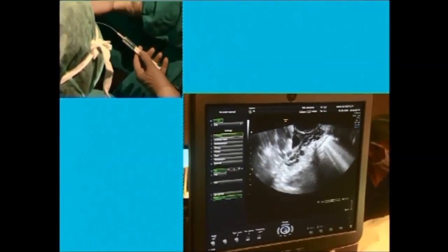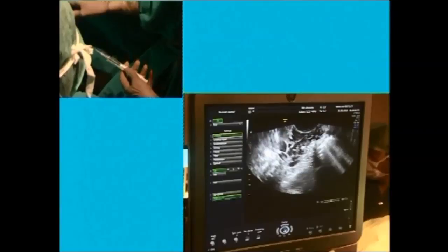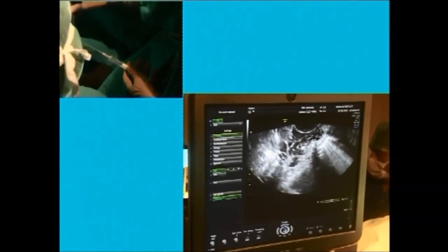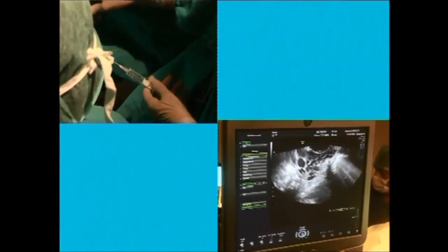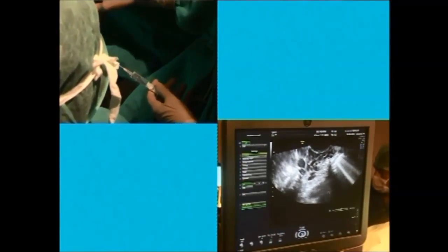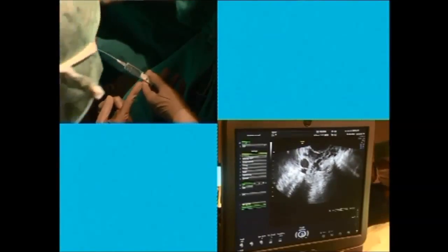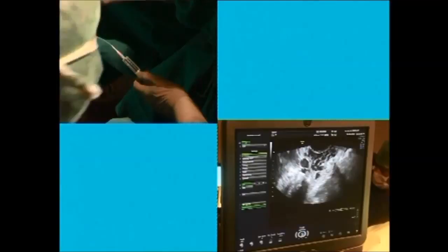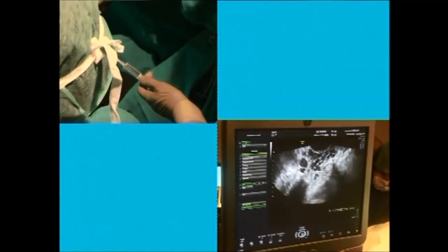This is the needle going in. The aspiration pump has started and I have emptied the follicle. Ideally, after stopping the suction, you should push the fluid at the same point without withdrawing.